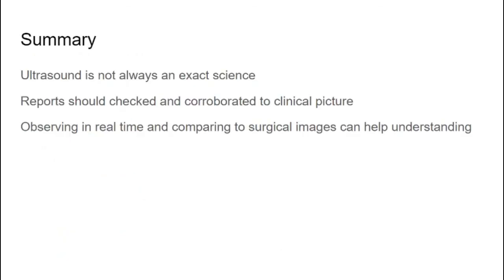So to summarise, ultrasound's not an exact science. You're getting the sonographer's best impression. Things can be missed or they can be misdiagnosed, so it's always important to check and corroborate this to the clinical picture. Does this make sense? Are we missing something?